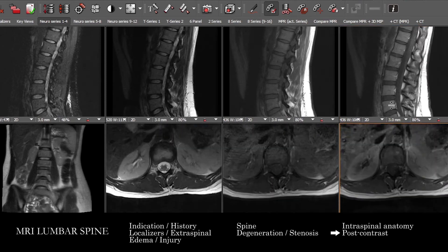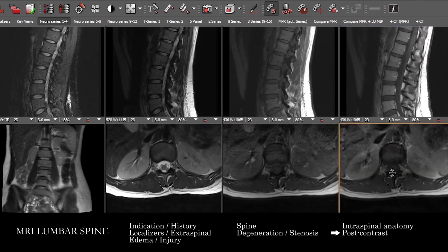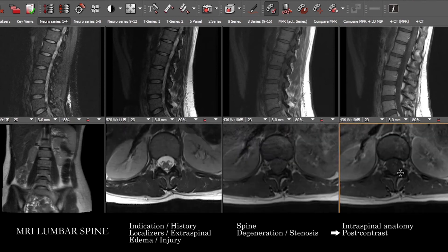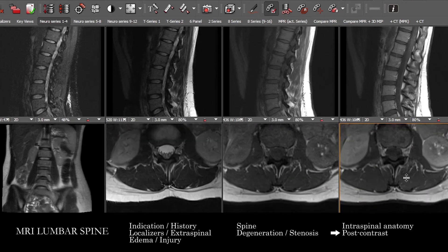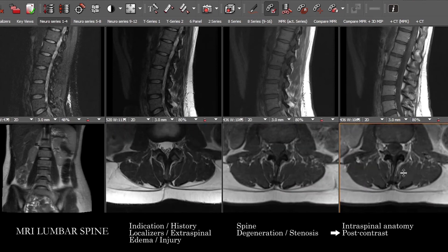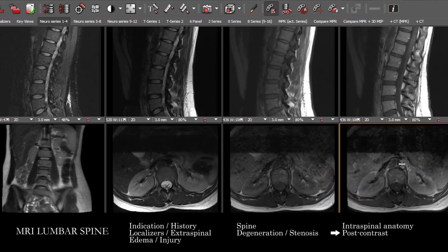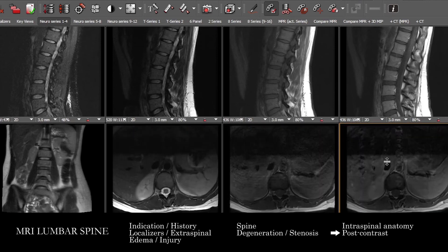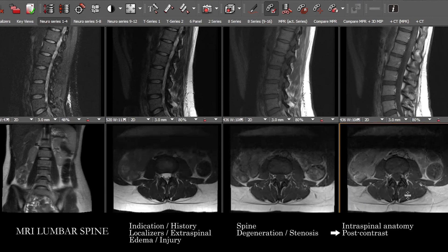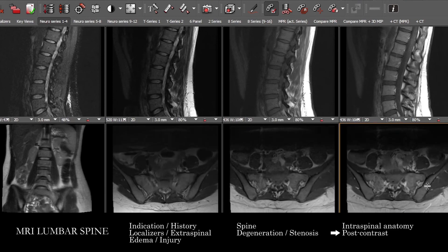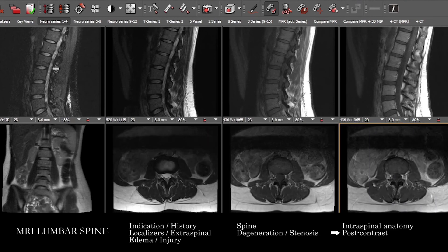As you scroll up and down you'll see some small vessels in the intraspinal compartment. If you haven't looked at the extraspinal anatomy on the post-contrast images, it's especially important to go through that carefully — you can pick up incidental pathology and characterize things you've already seen.